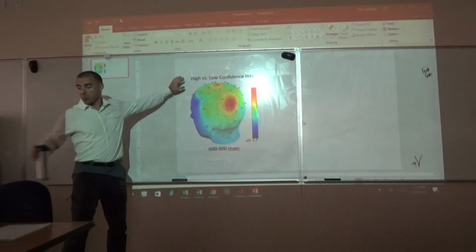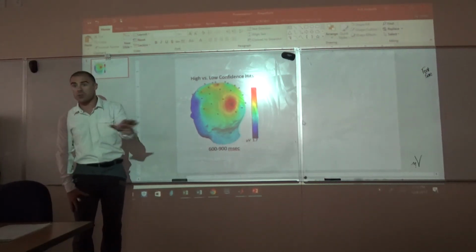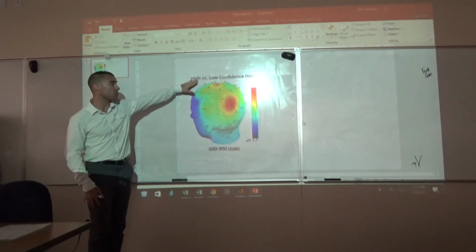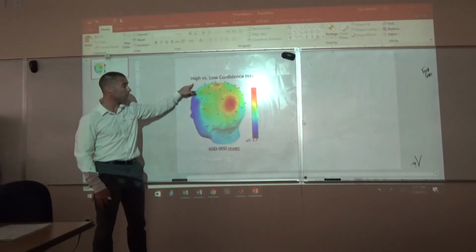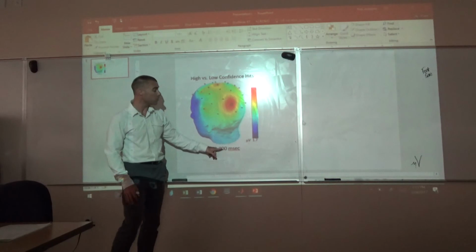so we have the important elements that we need here, and that all of your figures have to have, whether it's a 3D map or a 2D flat map. You got to have the conditions labeled of what is being contrasted, because every single one should be a difference wave, subtracting one condition from another. Okay? We want to know the latency, the time that it's reflecting. All right, what window?